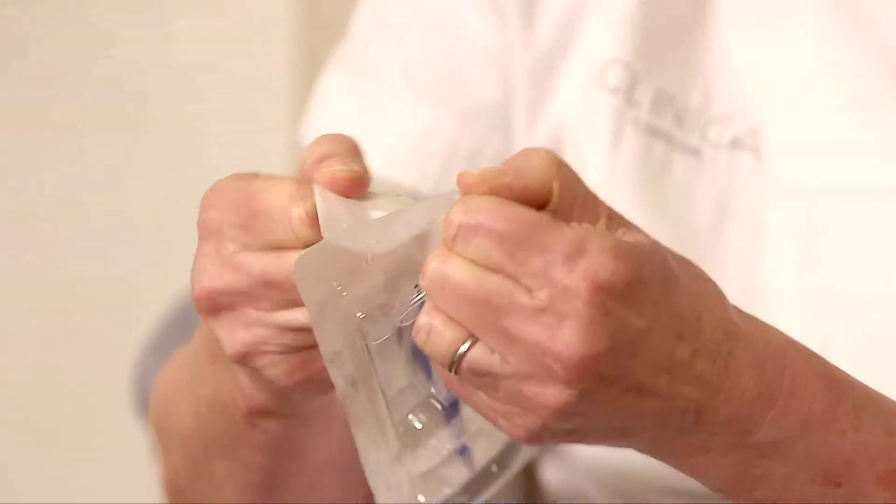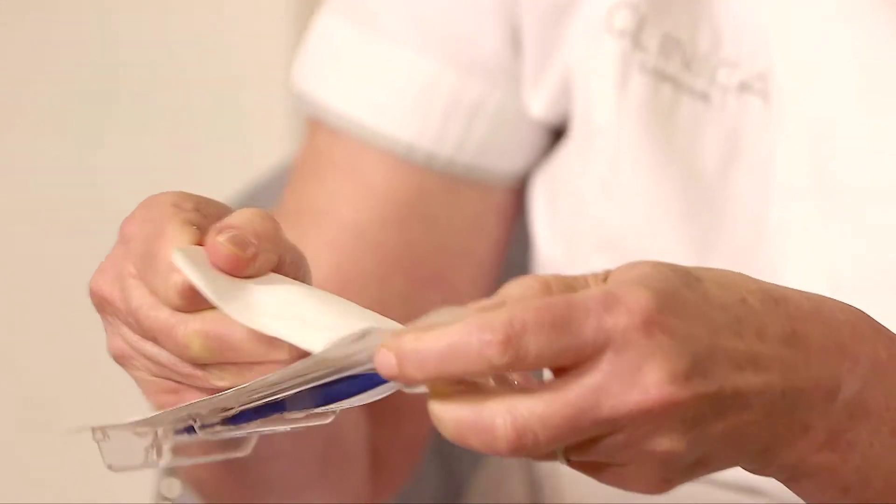The procedure is actually done in our minor theatre here at Clinica London. I wear sterile gloves, wash my hands, use sterile equipment, and then we open the pack. But for the purpose of this demonstration we'll just show you here what it looks like.